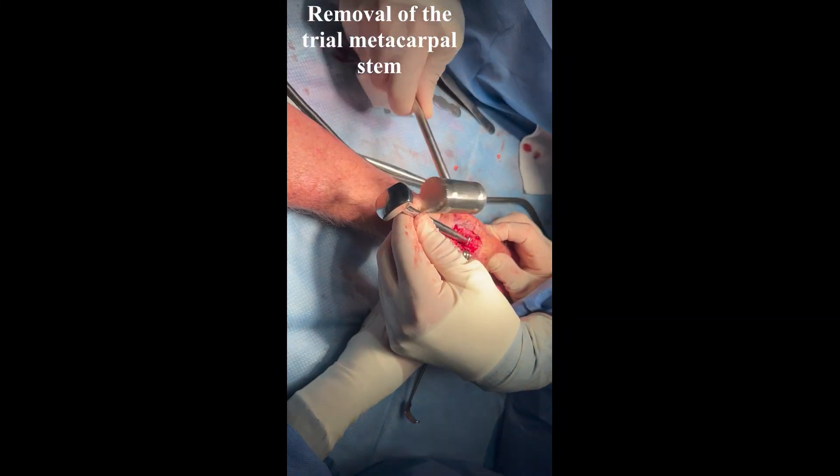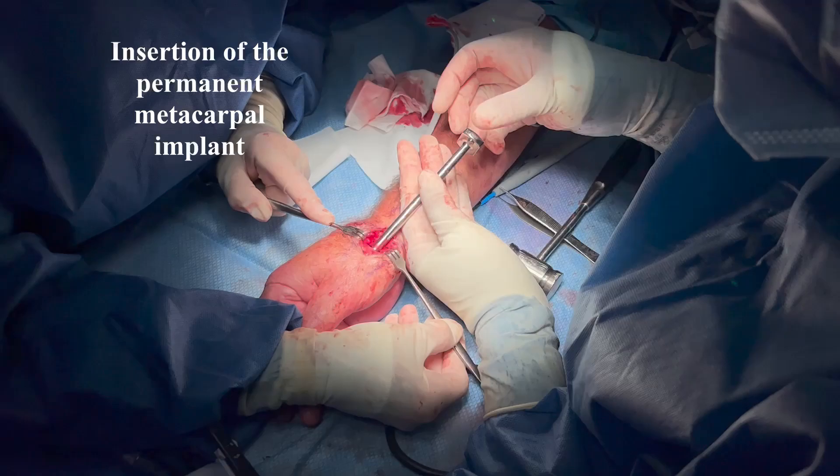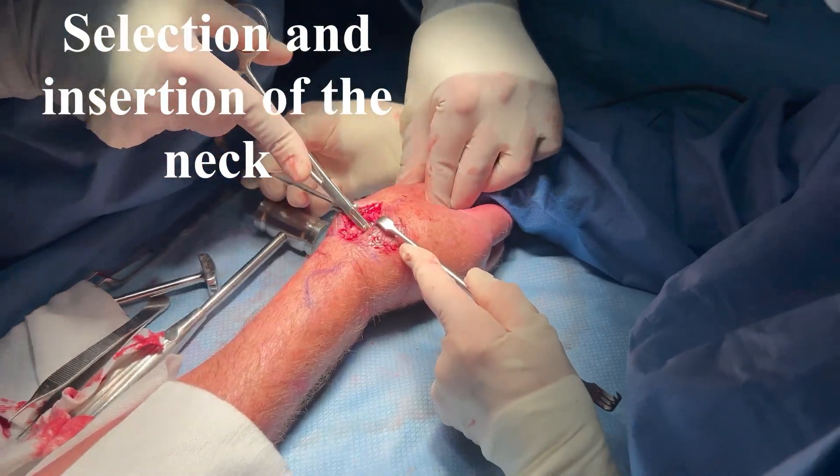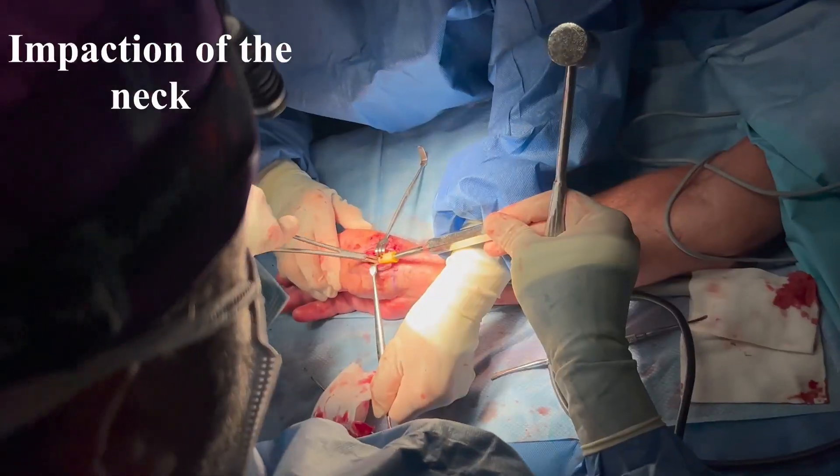The permanent implant is tested for stability after impaction. The trial stem is removed and replaced with a permanent implant. Next, the neck is selected, inserted and impacted.